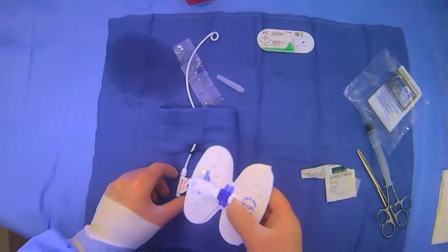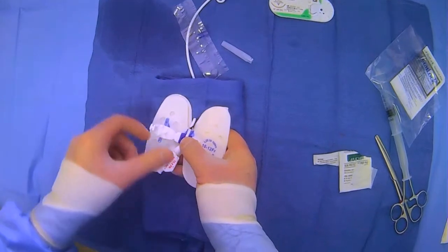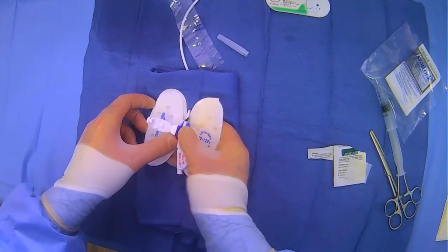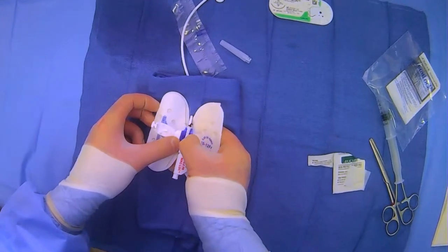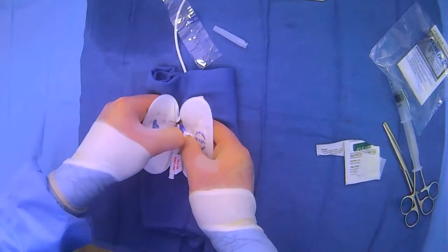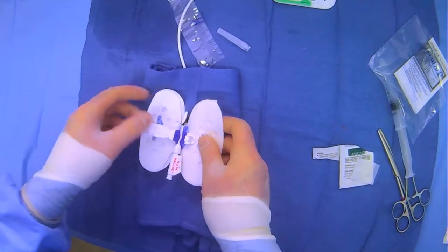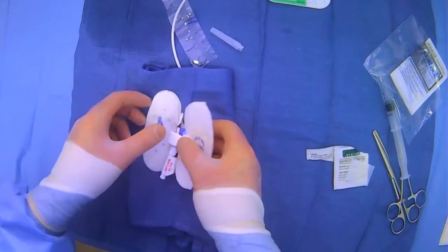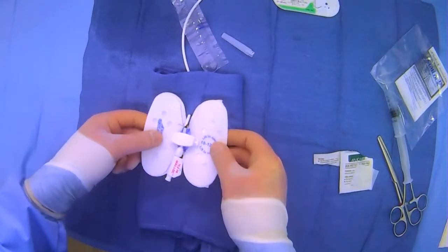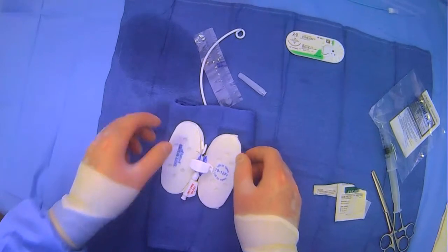There are a few different ways to do this, but one good way is to actually put the tube into the stat lock — into the little tract where it's meant to go — and lock it into place first, before you apply any stickiness. Now that it is locked, you can get a sense of where you want to stick it.